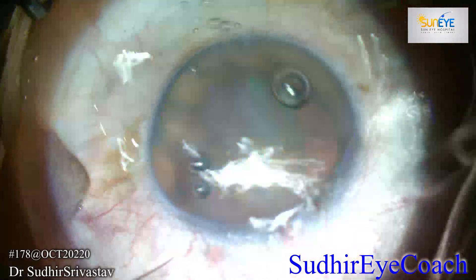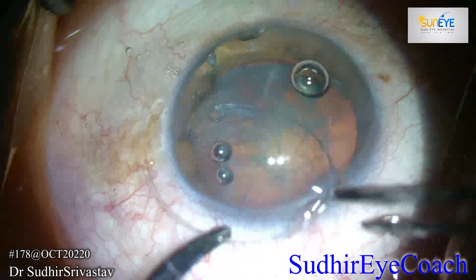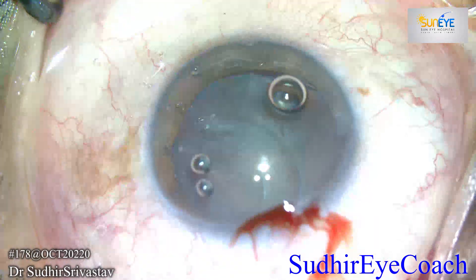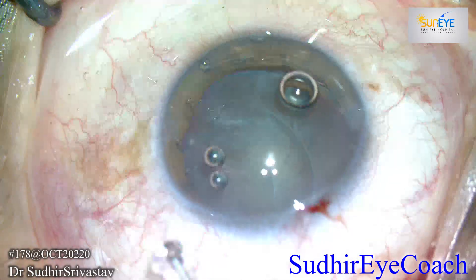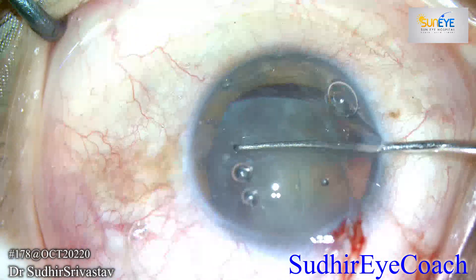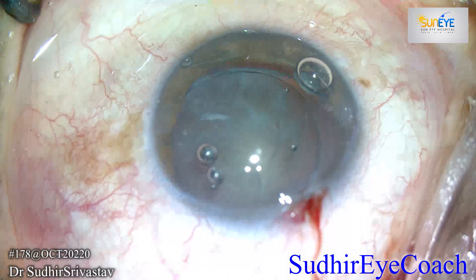The endocapsular ring has two sets of rings present at the tips, and they are for manipulation. Before inserting it in the bag, always assess that your leading tip must be inside the capsule. It may take a couple of moments, but it is always necessary that your ring should be in a proper place.